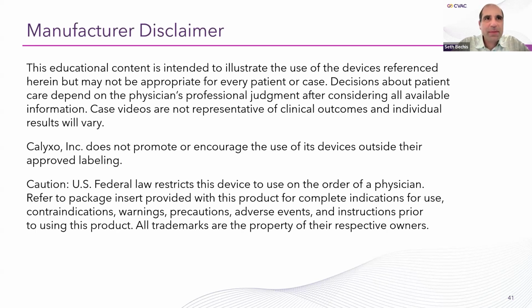I think I've incorporated some techniques along the way that help make the cases go even faster and more efficiently. But just getting familiar with the balance of the irrigation and the passive aspiration, and then how you use the manual trigger to take advantage of its full aspiration capability. And as you're dusting, if you have to do some fragmenting, I think taking that extra time to really make sure all your stone fragments are small, less than 2 millimeters, before you remove your laser and switch over to the full aspiration.